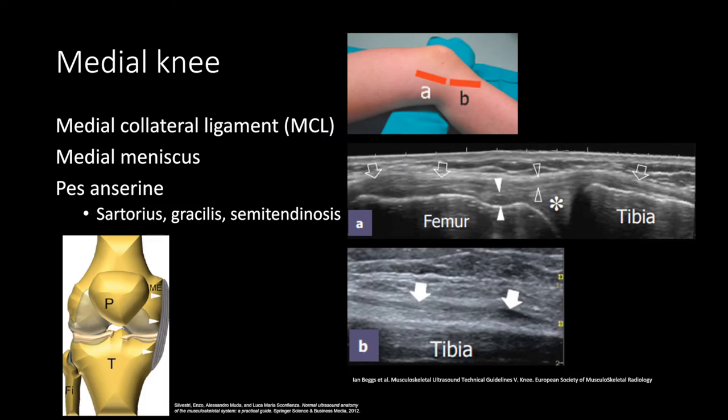For evaluation of the medial knee, rotate the leg externally while maintaining 20 to 30 degrees of knee flexion. The main structures are the MCL and the pes anserine complex. The medial meniscus can sometimes be evaluated as well, but it is more difficult due to how deep the structure is. The middle images show the empty arrows pointing at the MCL; the empty and white arrowheads are the superficial and deep layers of the MCL, and the asterisk is the medial meniscus. If you rotate the transducer forward, you can see the pes anserine complex, labeled by the white arrows on the bottom right image.